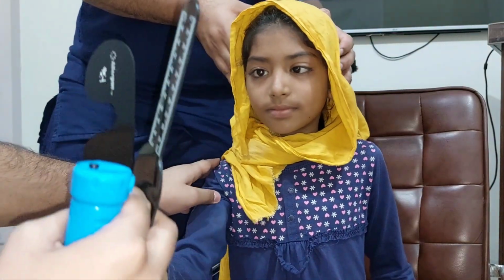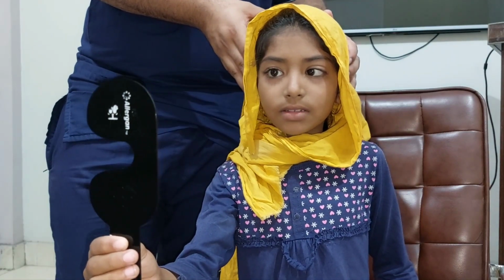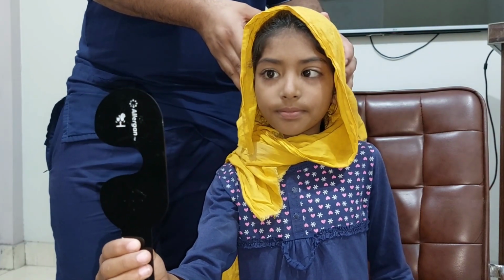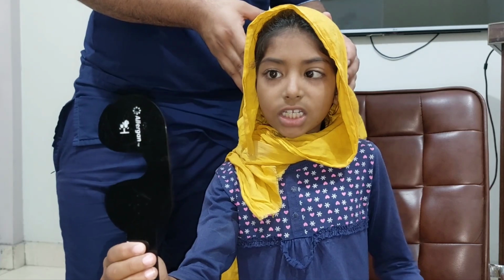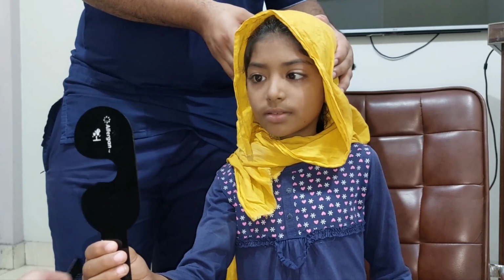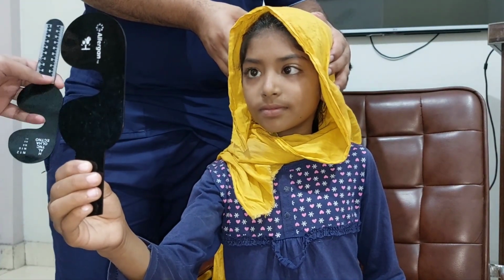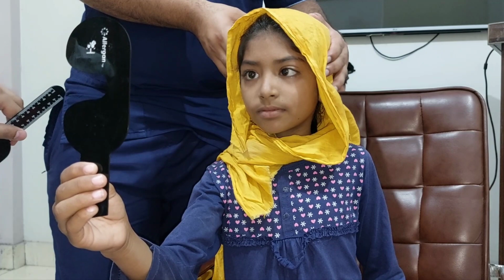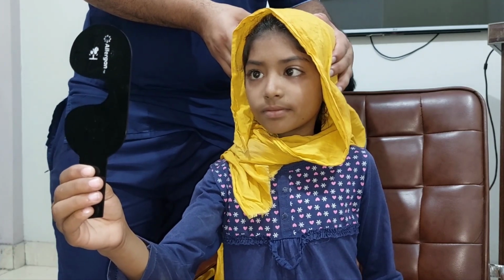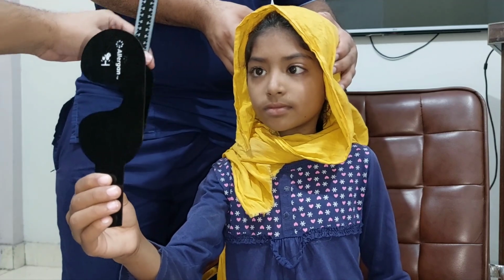Keep your head like this, not like this. Abnormal head posture. First we have to measure it in primary position. Still the face is turning slightly towards left. Tilt it a little to the right, like this, and don't let it come back, so that it is checked in primary position. Head should be straight and eyes should be straight, head facing straight ahead.